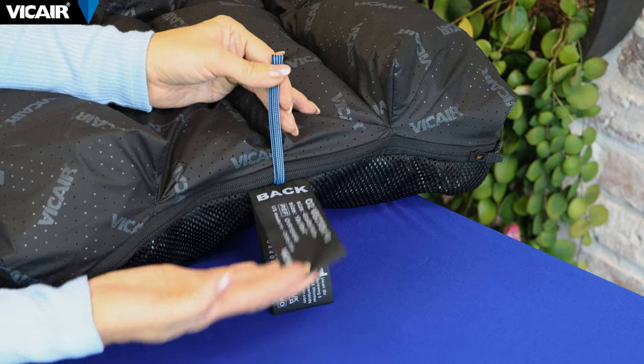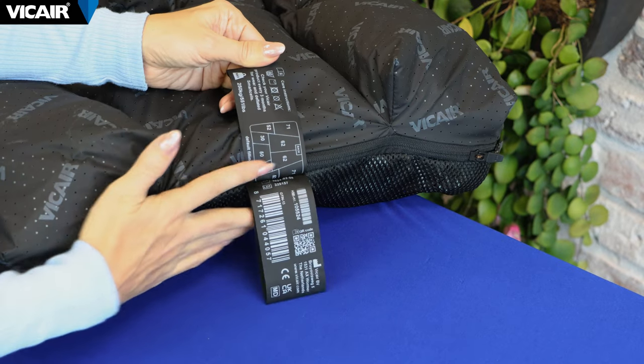The original filling grade of the cushion can be found on the cushion label. You can always find the complete maintenance and installation instructions in the cushion's user manual and quick installation guide on our website vicair.com.